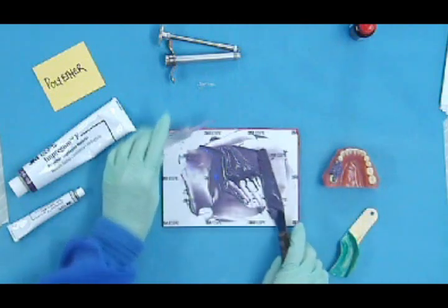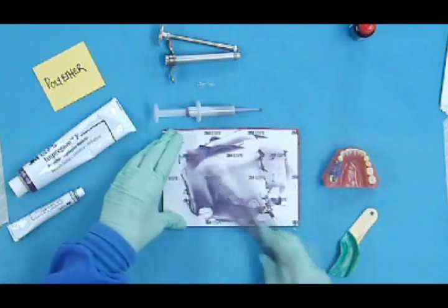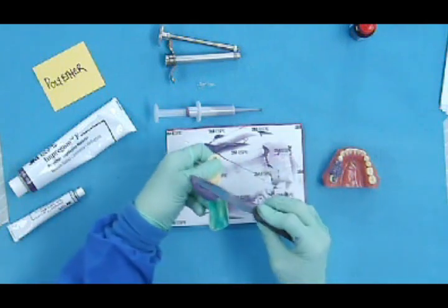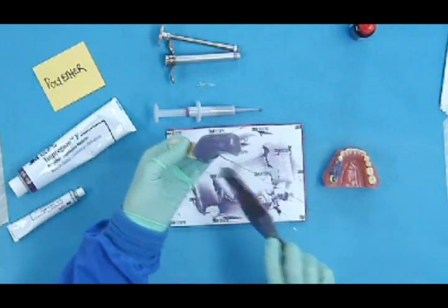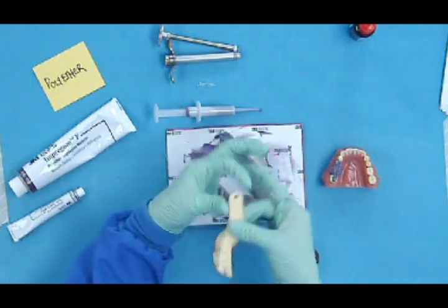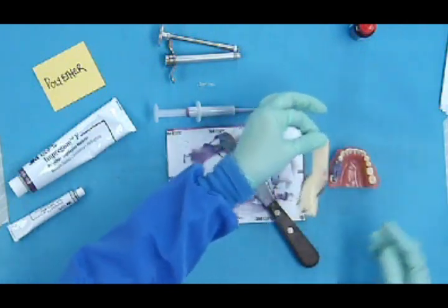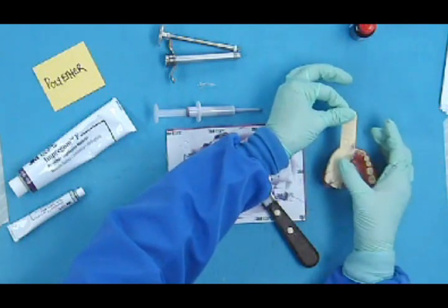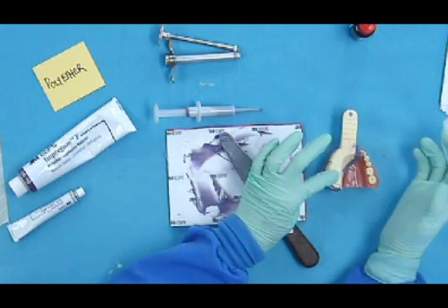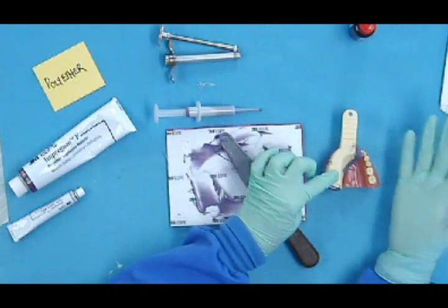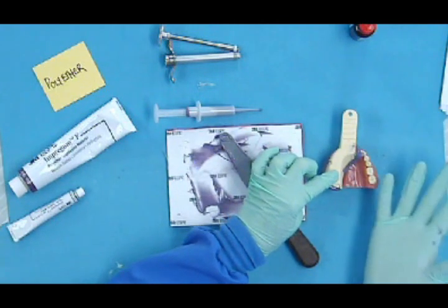So the prep is covered. The adjacent teeth are covered. While he's doing that or she's doing that, I'm going to be loading the impression tray. Then passing it to the doctor like this. And the doctor will seat it in the patient's mouth. And it's your turn to hold the impression for a little bit until the material is set.